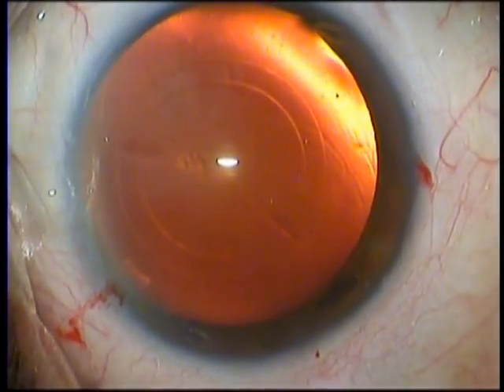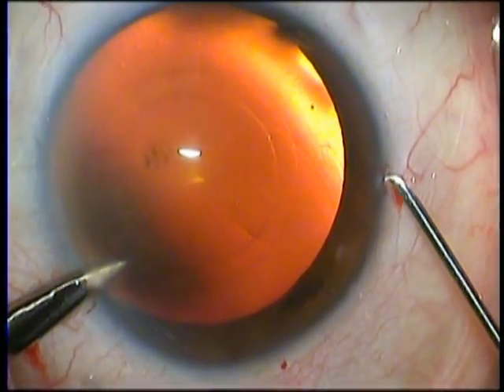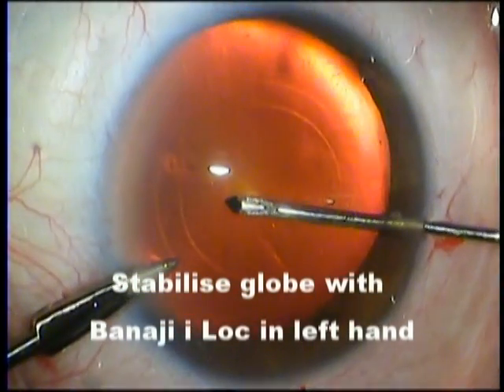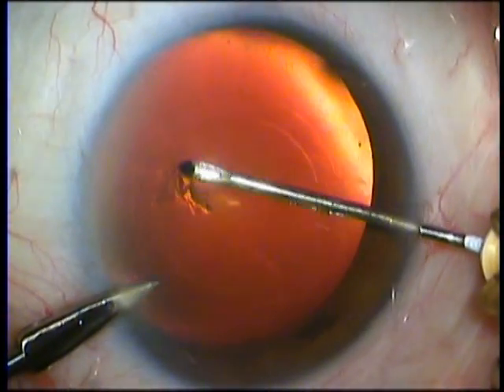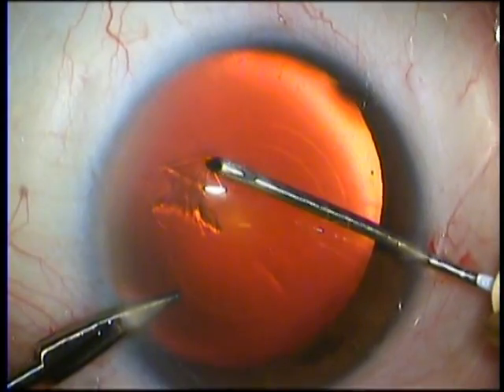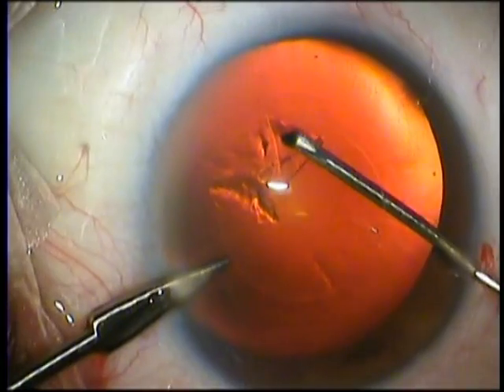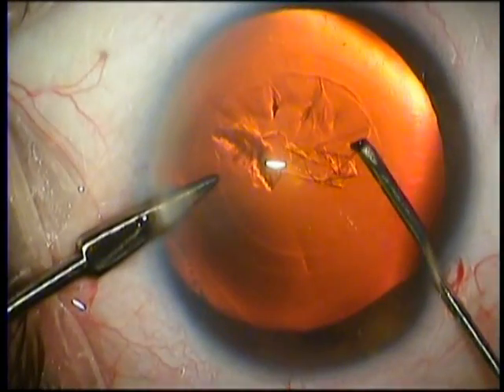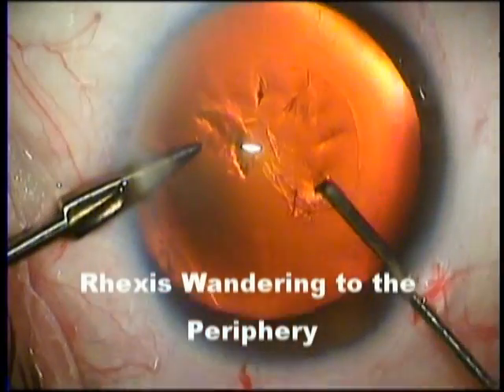Now you see the double ring here. The double ring is basically a road map. You have to stick within the inner and outer ring to make your rhexis of the correct size and of the correct orientation. Here we start the rhexis from the center towards the periphery, and you can see here we start turning the corner just about between the first and the second ring. It is important that you stabilize the globe with the left hand using the eye lock. If you do not, then it will be very difficult to technically stay between these two rings.